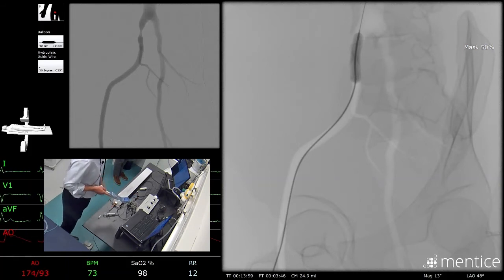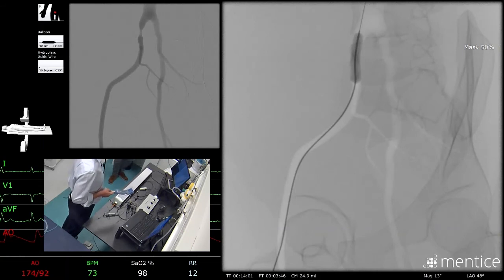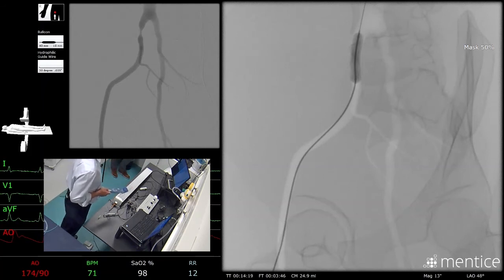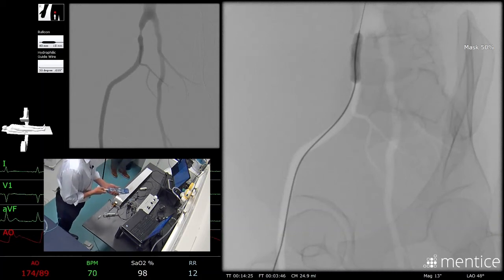The time of insufflation varies between different operators. Most people would leave the balloon up for at least 30 seconds, I believe, deflate, and then quickly inflate a second time is my standard practice, depending on how easy it is to get out to the nominal diameter. So you prefer always to try and get the balloon out to its nominal diameter, as shown in this particular case. So roughly after 30 seconds or so, I would deflate the balloon.